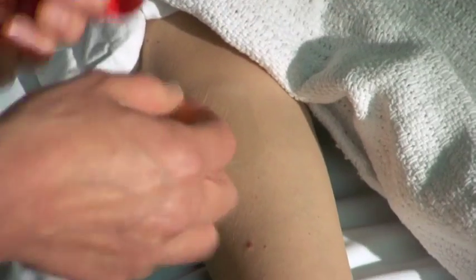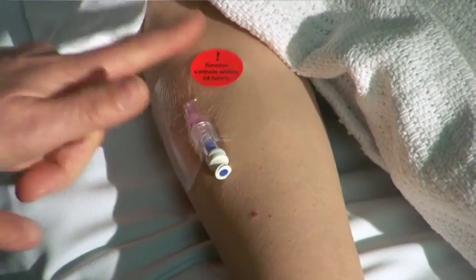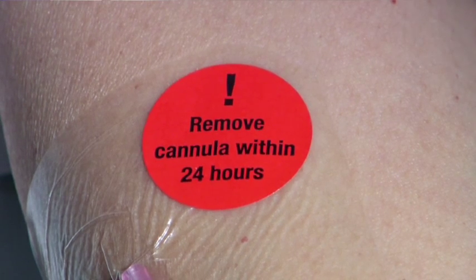Sometimes we mightn't be sure about the circumstances of how some IV lines were placed. Peripheral IV cannulas inserted outside the hospital or those put in during a medical emergency may not be as clean as usual and are more likely to become infected. In these cases, they should be removed or replaced.